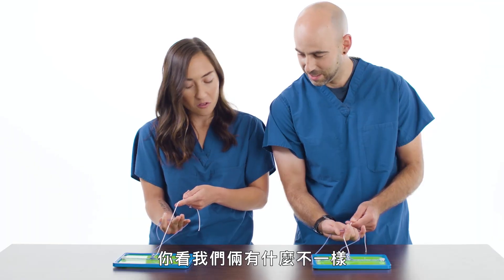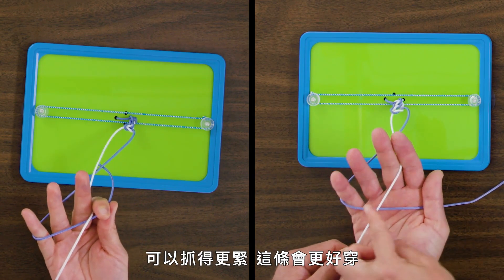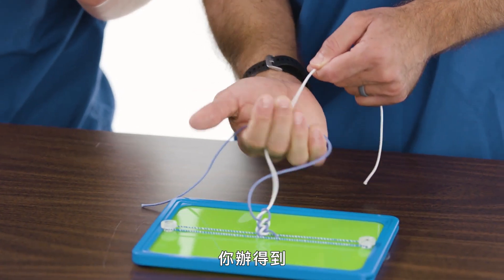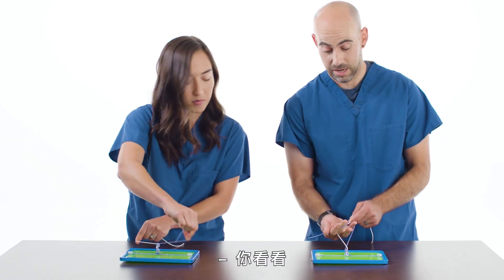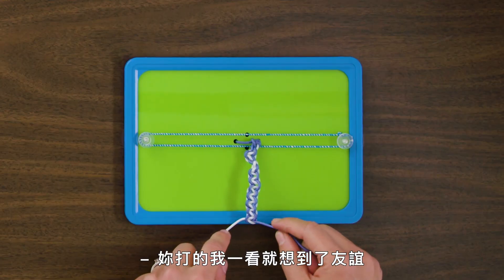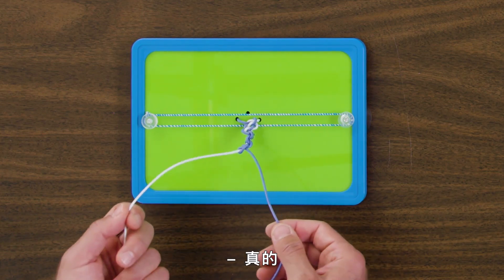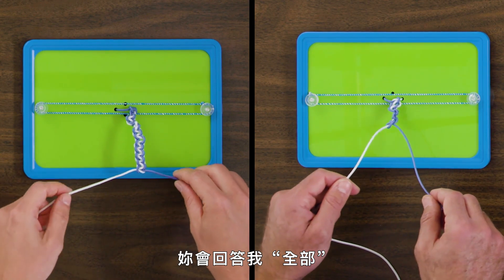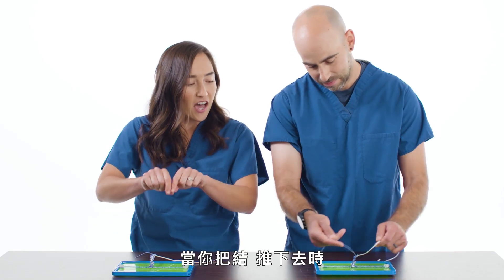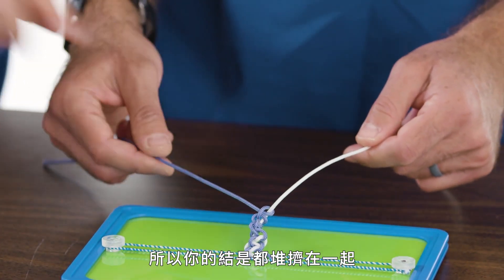Here's the difference between me and you — look where your purple string is versus where mine is. I've got it around the whole hand, and that gives you a little tension to make this easier. I'm so good — one hand! I'm going to hire you. I look at yours and I see friendship, and here I see rancor and years of bitterness. The problem is that as the knot is going down, you're not applying even tension, so your knots are ending up stacked instead of square.